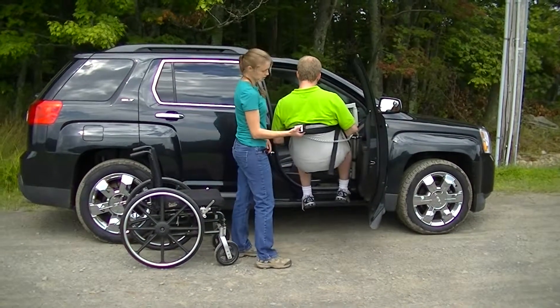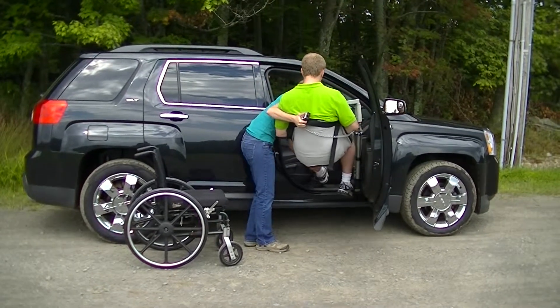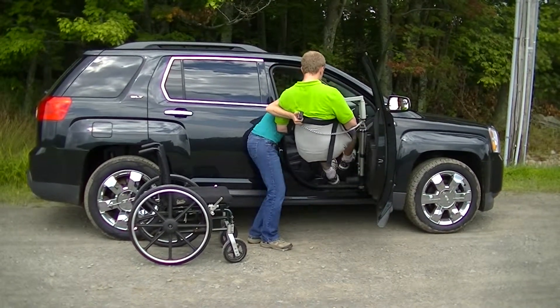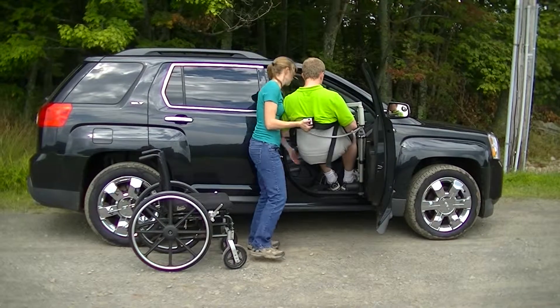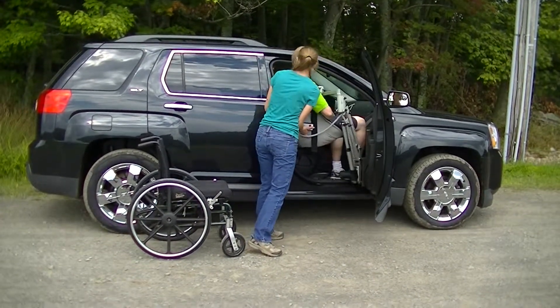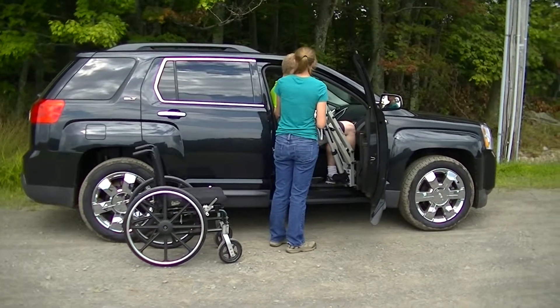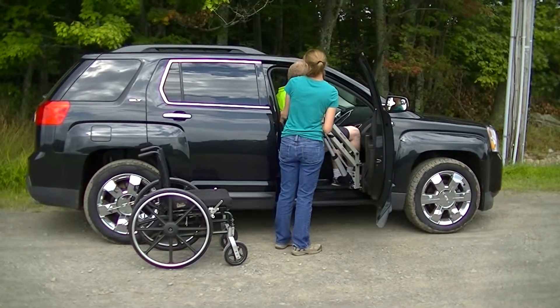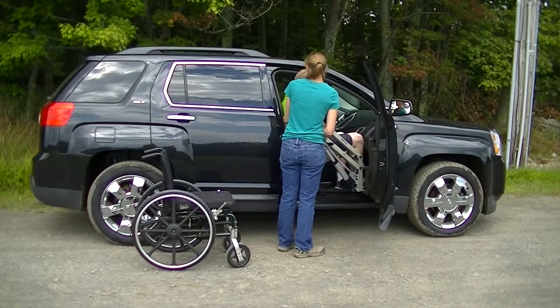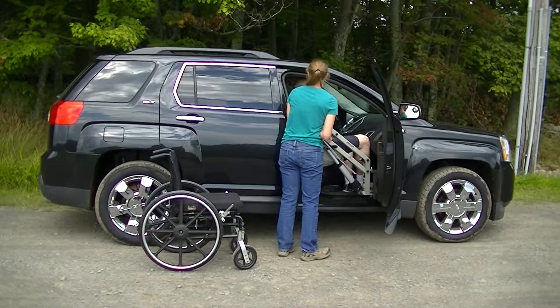I can use this strap to help guide us. I'm going to get the legs into position and give him a little help guiding through. When he gets to the door opening, I'm going to go down just a little bit so he can get through the door, and then we're going to go back up so he can be above the seat.